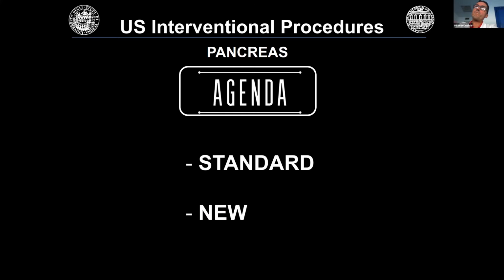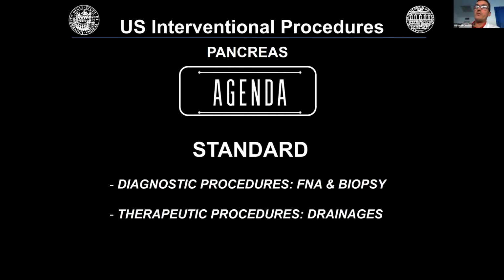So I will show you a standard procedure, and then we will move to a new application, new procedures that we need to know. And among these new applications, I will speak also about fusion imaging.